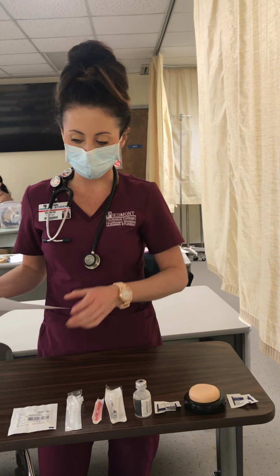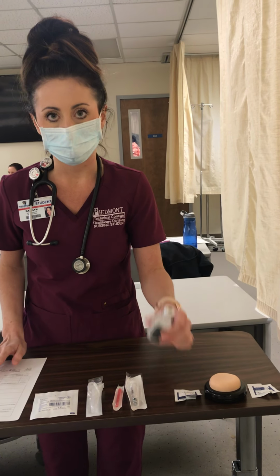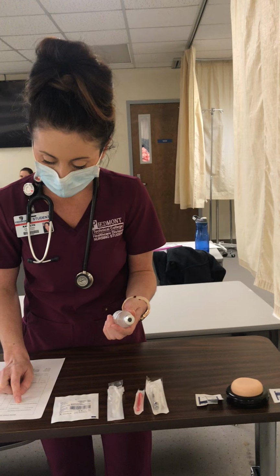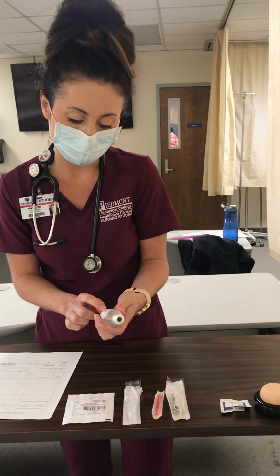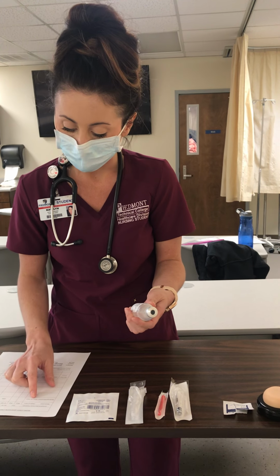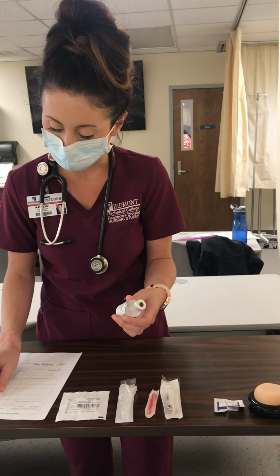It is now 8:50. I'm going to verify that I have the correct medication here. So I have methylprednisolone, 30 milligrams. I have 40 milligrams on hand, but I've done my dosage calculation and I know that I'll be giving 0.8 milliliters. This will be given IM daily at 0-900.